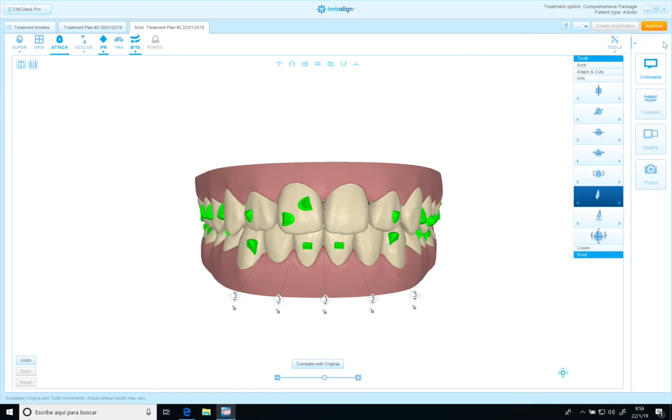I'm working with this Clean Check. It's the second modification. I'm going to change a few things.